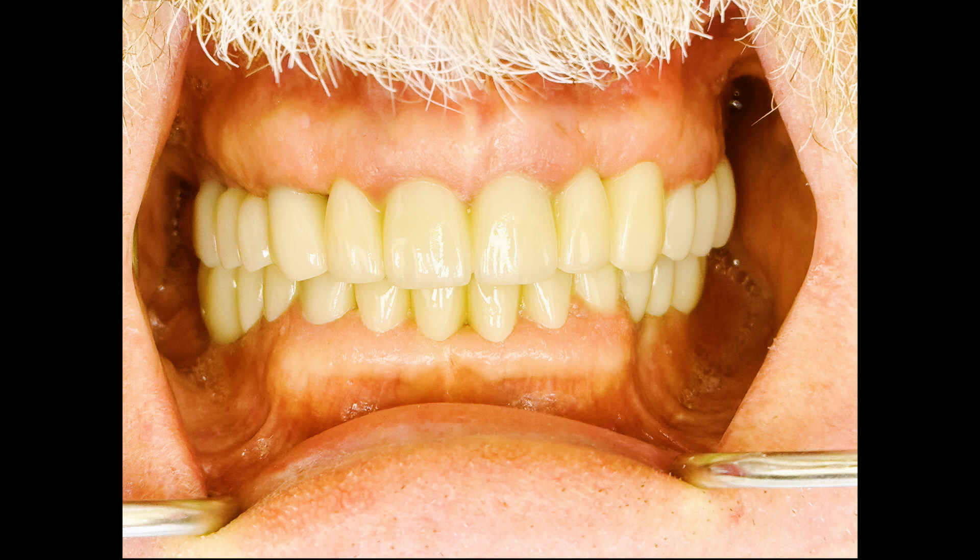You just have those beautiful teeth coming right out of the gums on top and on the bottom. And you look at the extreme and you're like, oh, those aren't actually his teeth — those are the three-on-six. That's three bridges on top of six implants. This is a great patient because it shows that if everything is done correctly and if the patient is able to take care of their hygiene correctly, we're able to maintain that beautiful smile forever.